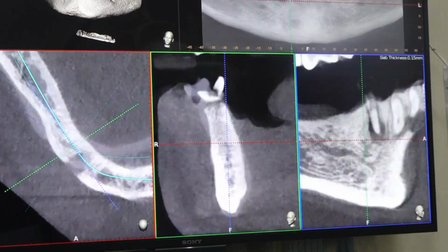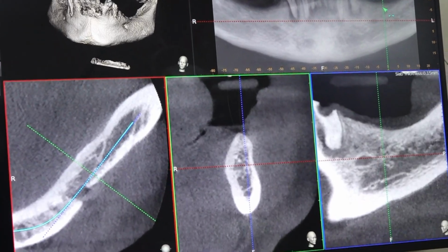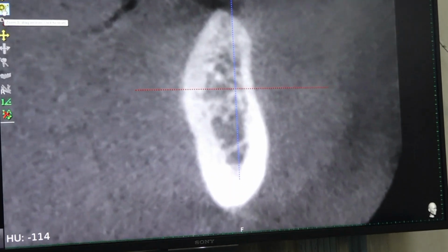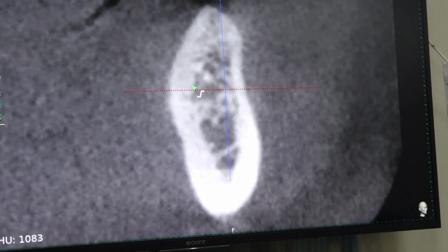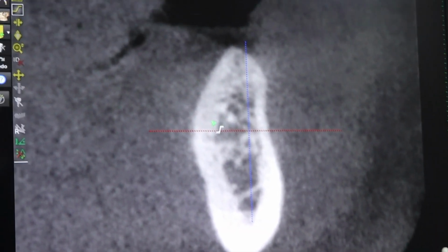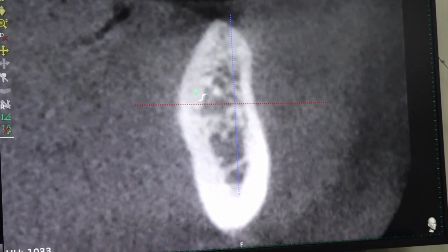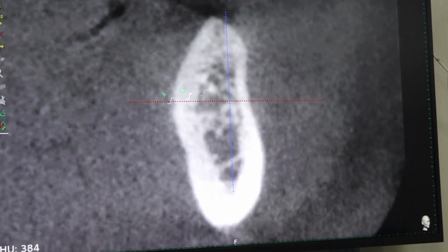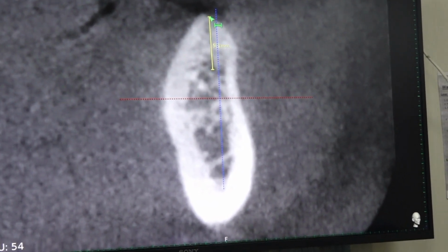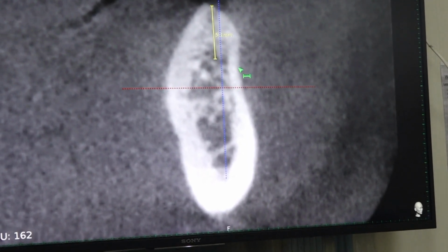We will see the left distal mandible. So this is the first molar area, right? Probably this is the canal. Okay, not this one. Canal is here. But naturally the patient has the higher canal. And apart from that, a lot of bone resorption. Okay. Here also around 5 mm only. So this is a difficult situation.